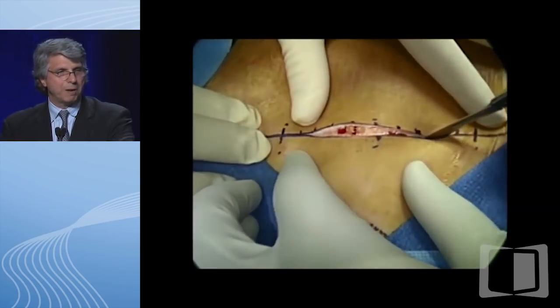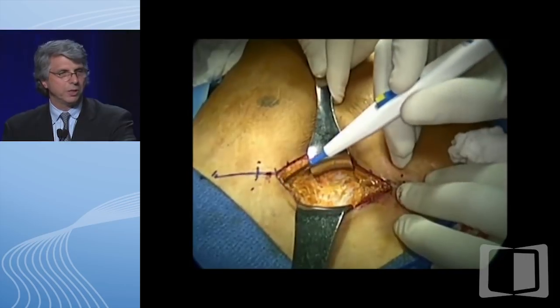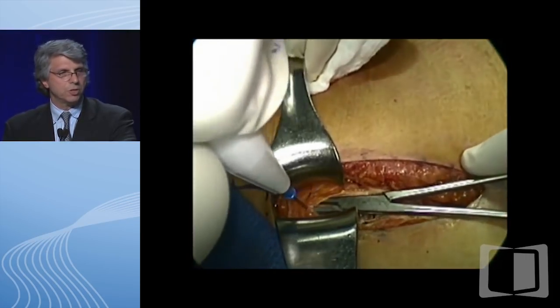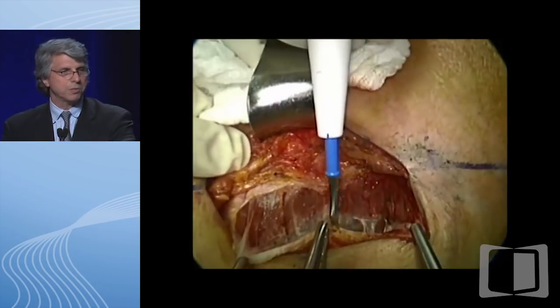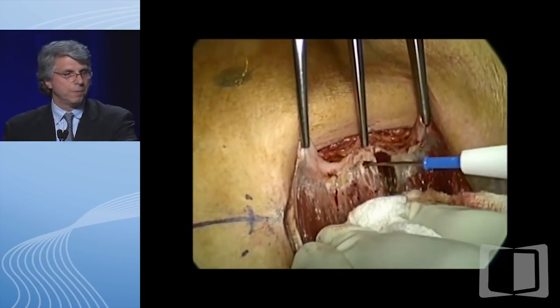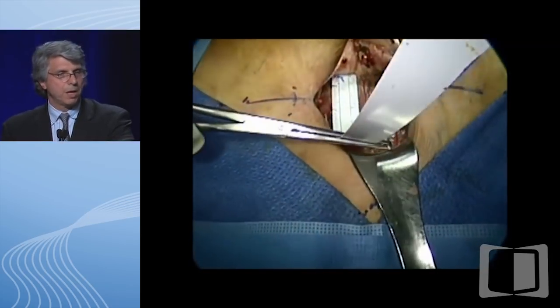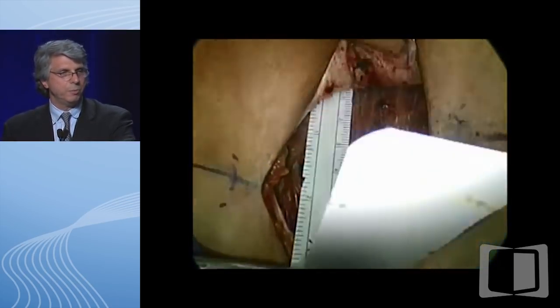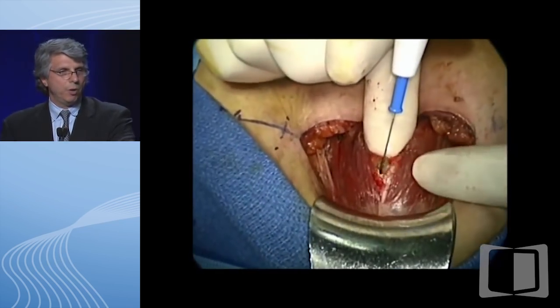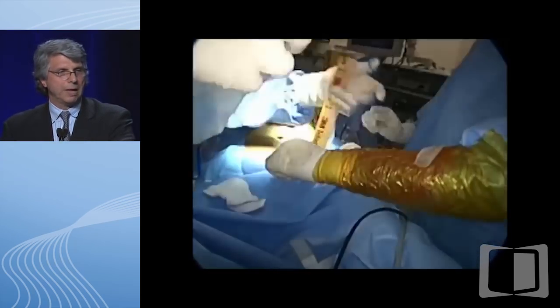The advantage of this particular incision is that it's actually below the hairline or below the bikini line, which is an advantage, particularly for young patients. Now you're in a different spot—probably where you were as a medical student, between the legs holding retractors. This is the incision going through the various layers. That's Scarpa's fascia. This is the anterior sheath of the rectus being pulled off, and then we have the muscle underneath. We usually measure out about an 8-centimeter incision underneath, and we open that up to gain access into the abdominal cavity.